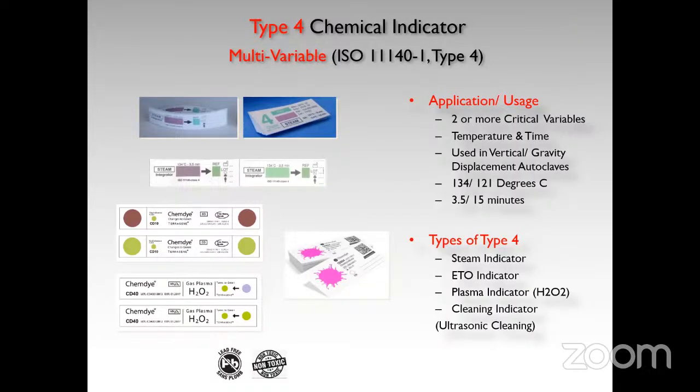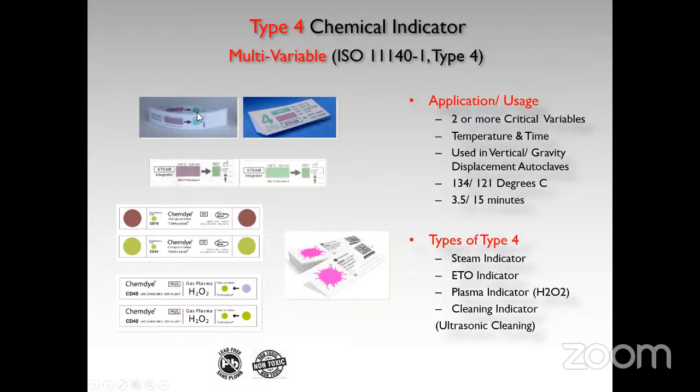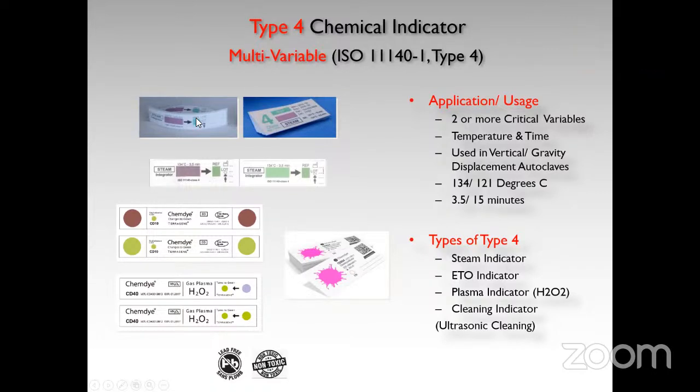So one question from Siddharth here. Yes, sir. You said this is to be kept inside the tray or a drum. That means it cannot be stuck on? No, sir. I mean, the type 4 indicators also have adhesive at the backside. Okay. They are there. Yes. So for documentation, if you want, you can paste it in the drum also.